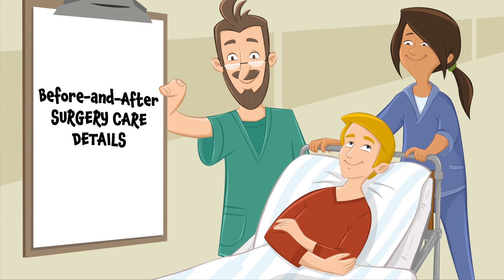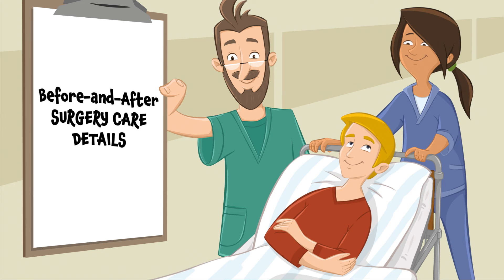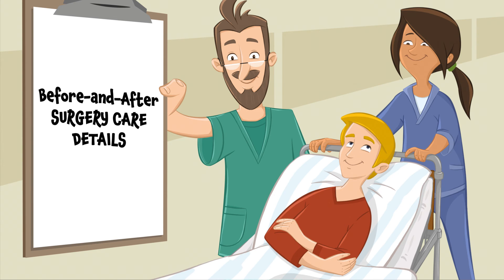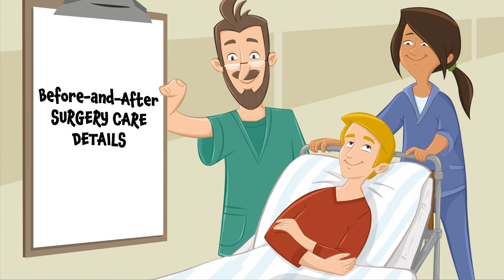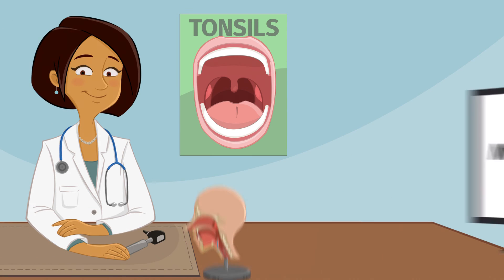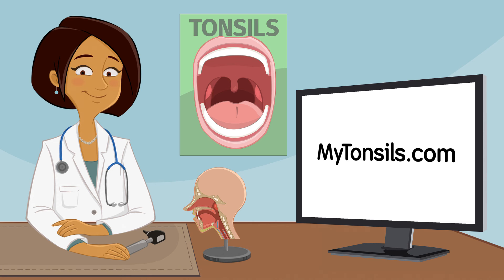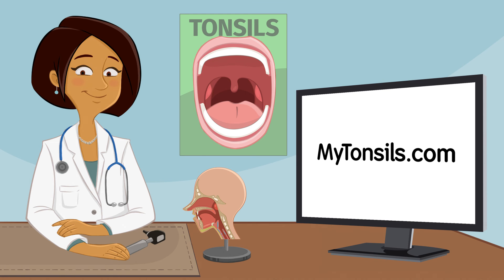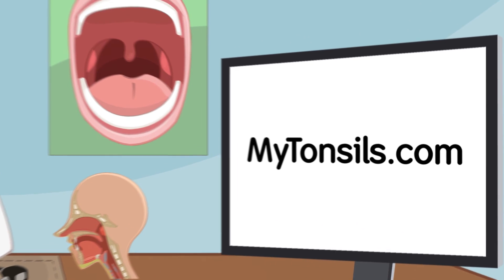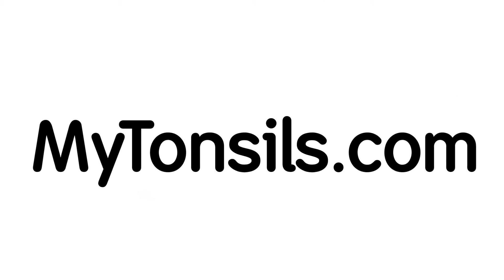Your doctor will provide you with the details of before and after surgery care. Any questions or concerns you may have should be discussed openly with your doctor. If you would like to learn more about your tonsils and the benefits of coblation technology for tonsillectomy procedures, make sure to consult your doctor and visit www.mytonsils.com.